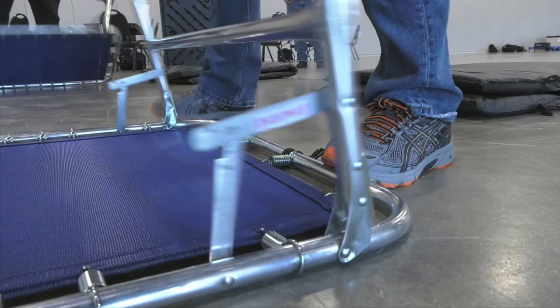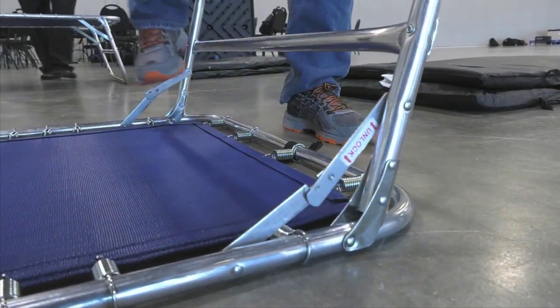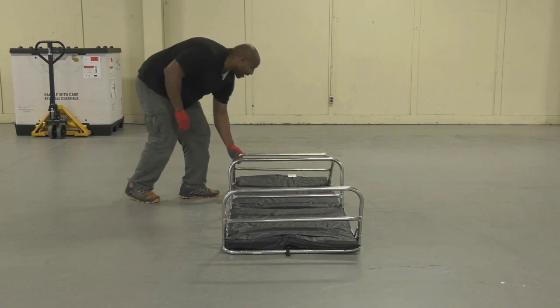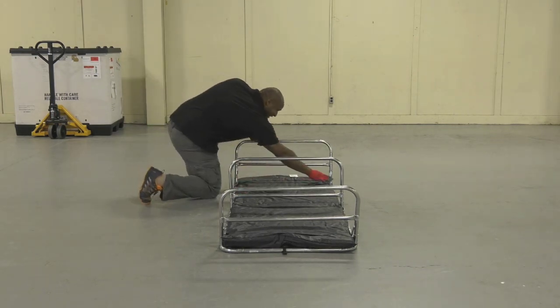Now secure the four hinges located at each end of the bed frame. To lock each hinge, simply push down — preferably using your foot. If you choose to use your hands, it's a good idea to wear gloves to avoid scratches, cuts, or other accidental injuries.